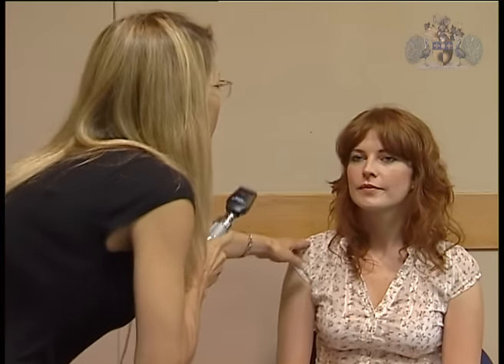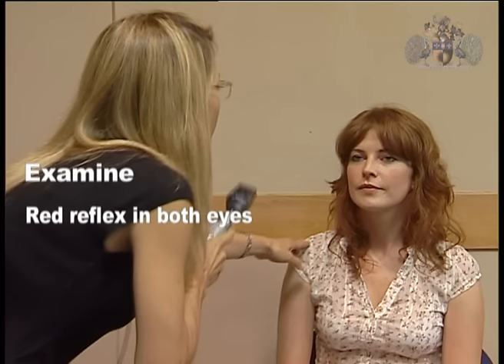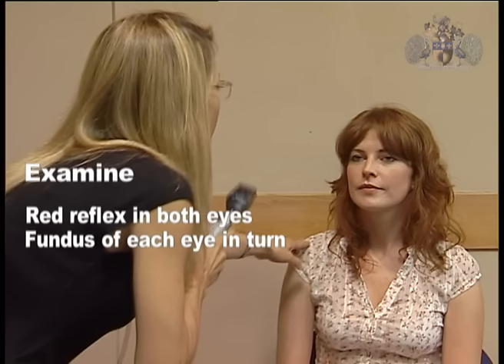Introduce yourself to the patient and explain what you're about to do — for example, mention that it will shine a bright light into their eye. You may need to rest your hand lightly on the cheek or brow, and you will need to move in very close for the examination. Ask the patient to let you know if they feel uncomfortable or need a break. Give clear instructions: ask them to look into the distance at a fixed target, such as a clock on the wall. Examine the red reflex in both eyes at the beginning, then the fundus of each eye in turn.